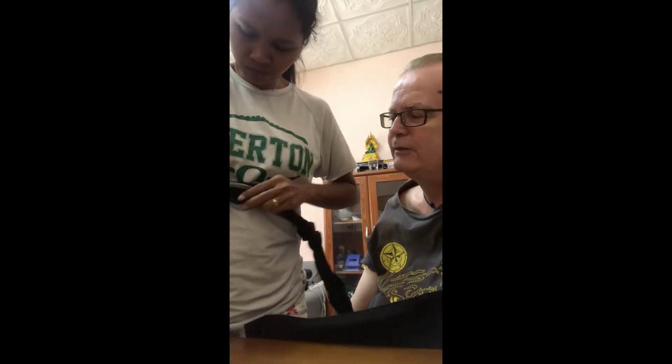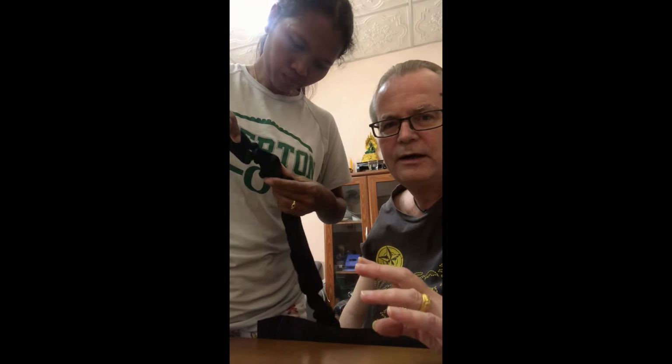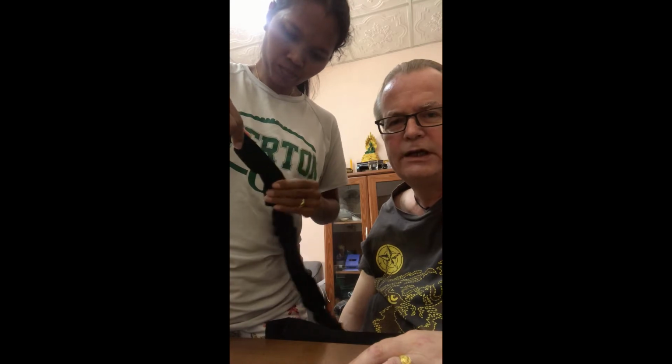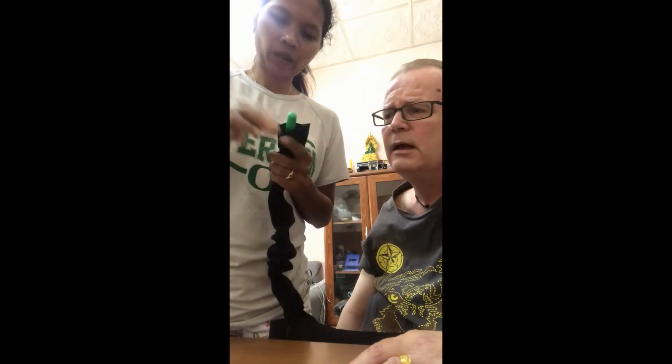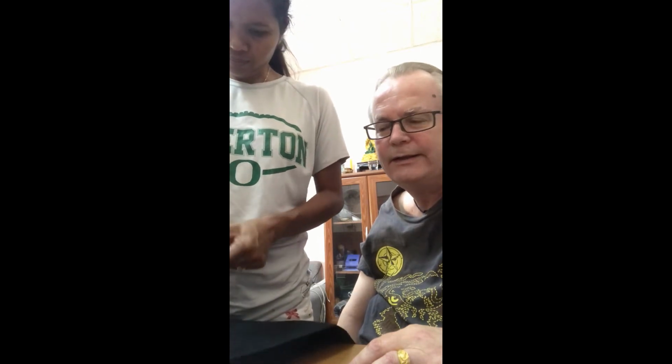So the most important thing then really, to recap, is to just make sure that you choose the right material. Now I understand that some people, and bearing in mind I'm a guy, so I wasn't particularly interested in having colourful flowery bags, but I assumed on the whole that people would like it to be not so obvious that it's a pretty bag, because it attracts attention, and people start saying what a beautiful bag you've got there, and then what's in it. That's probably what you want to avoid.